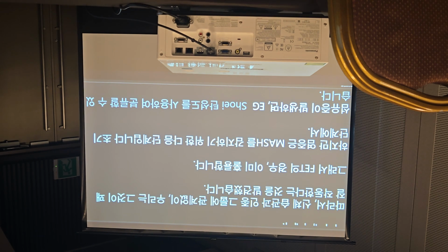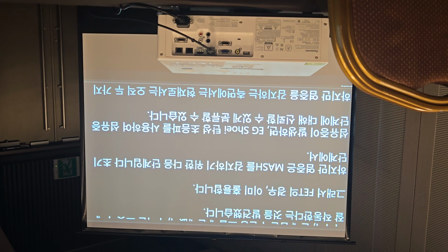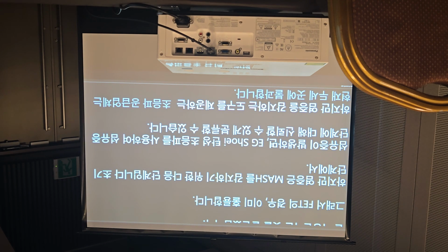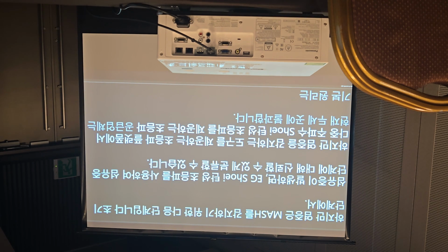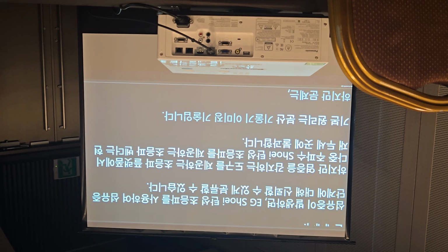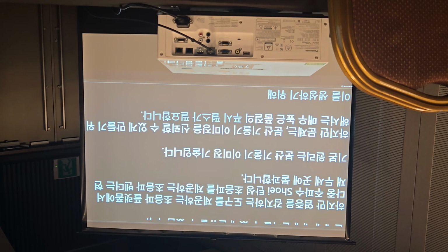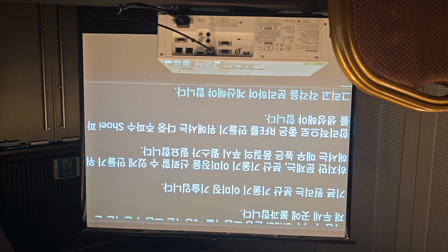But in terms of detection of inflammation, as of now, only two or three ultrasound vendors provide a multi-frequency shear wave elastography tool on the ultrasound platform. The basic principle is dispersion slope imaging technique. But the problem is, to make dispersion slope imaging reliable, we need a very high quality push pulse to create reasonably good RF, and we need a multi-frequency shear wave and then separately calculate the shear wave velocity.